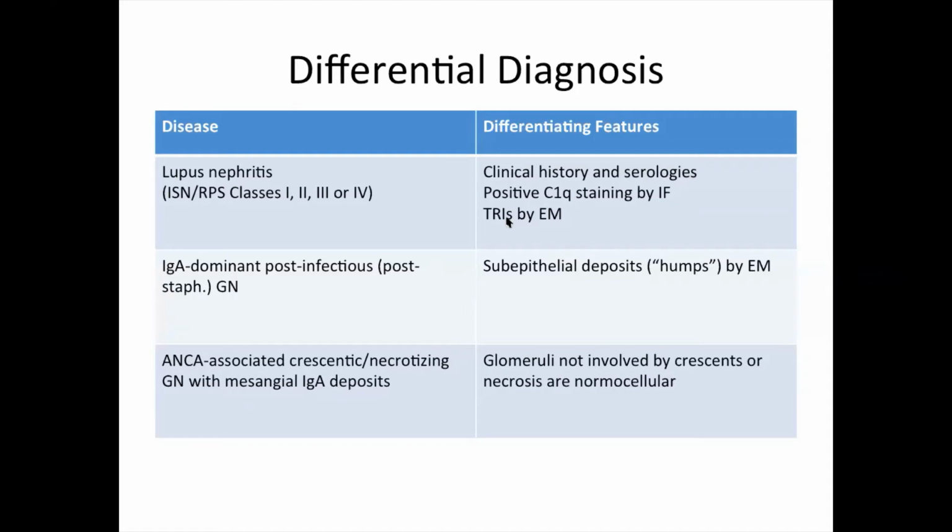So sometimes the glomeruli we have on IF may not show us IgA, but we see mesangial hypercellularity and red blood cell casts. So electron microscopy is essential to confirm the diagnosis. As we said, it can be segmental, it can be focal, and it can be of low intensity. I'm telling you all the scenarios. It wouldn't be ANCA in this situation, because the ANCA serologies would be positive.